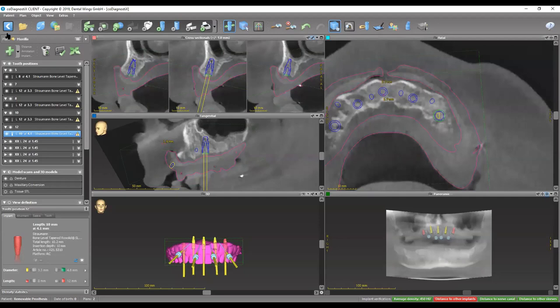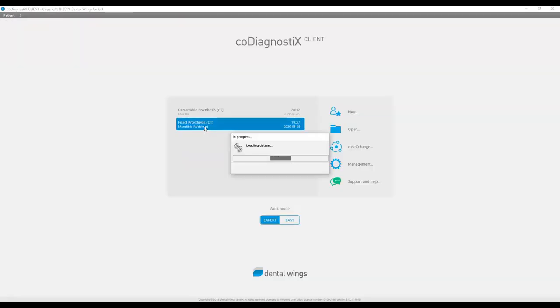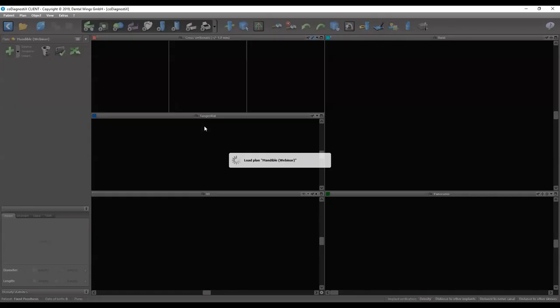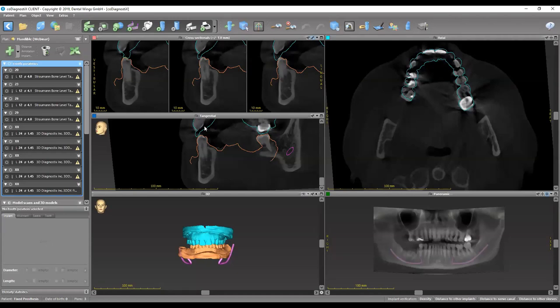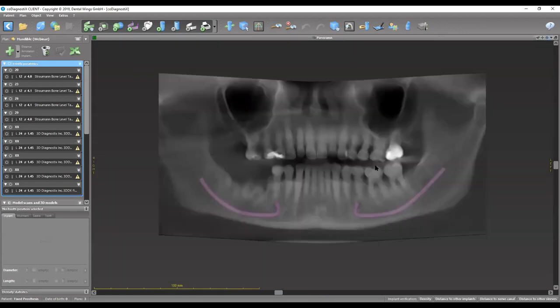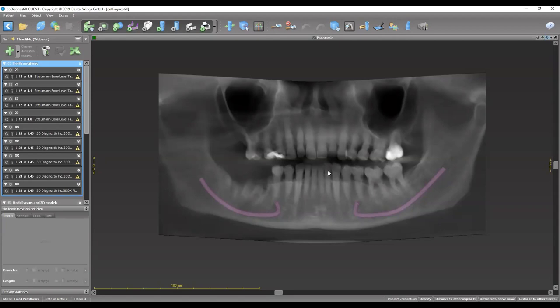Let's move on to a more complex plan — the fixed prosthesis. The fixed prosthesis has different guidelines and classification as mentioned before. Going in to plan a fixed prosthesis, you need more information — whether the patient has existing teeth or is completely edentulous. We selected a scan with a patient having teeth, so first we're going to make sure the vertical clearance is enough to accommodate a fixed prosthesis. According to literature, a fixed prosthesis requires around 15 to 17 millimeters of occlusal clearance from the platform of the implant to the occlusal table.